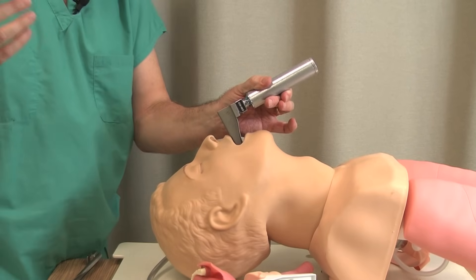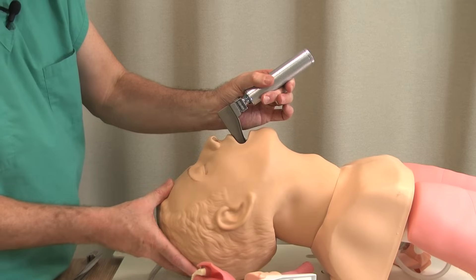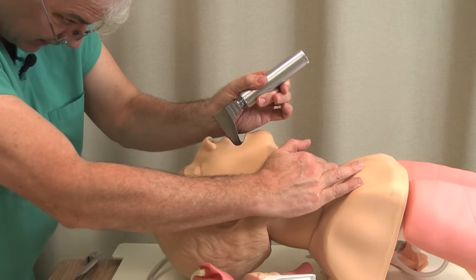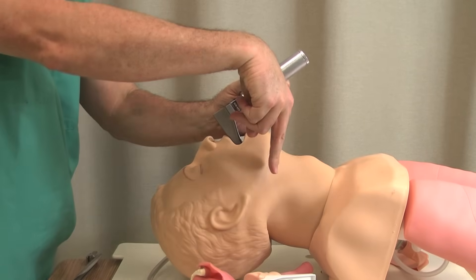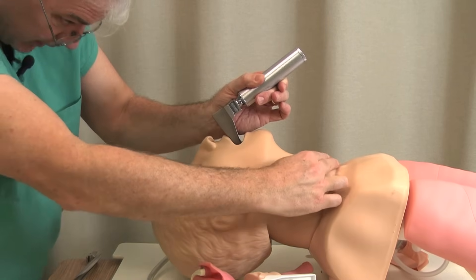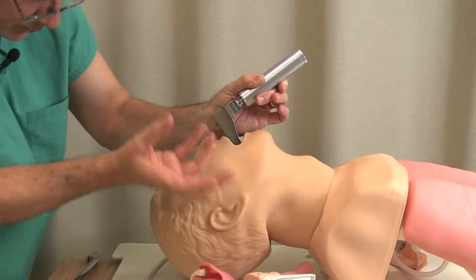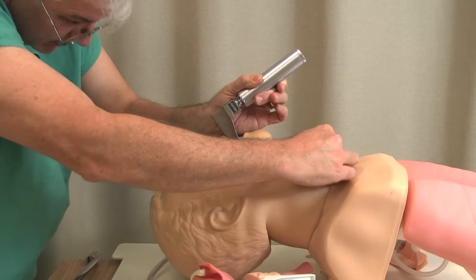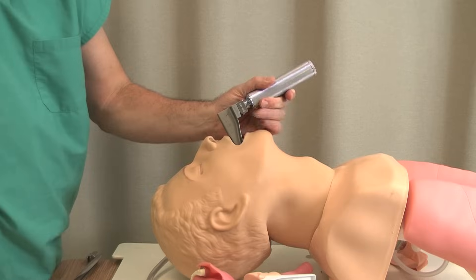Let's say I can't quite get the view — sometimes this helps. You reach up with your right hand and push down on the larynx externally. A lot of times this will bring the cords into view. The cords will tend to run away anteriorly, but sometimes you can push down and get them into view. When you do that, obviously you'll need to reach away to get the endotracheal tube, so that's when you ask someone to come over and put their hand just like that — which allows you to put it in.